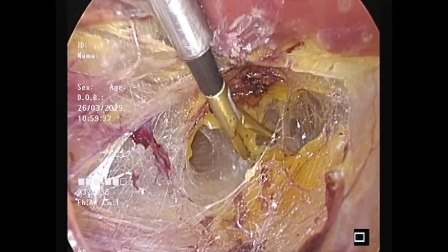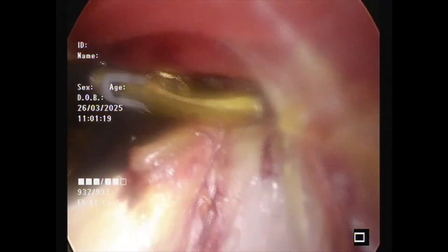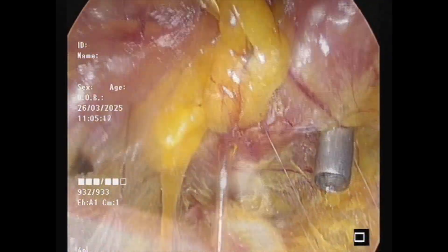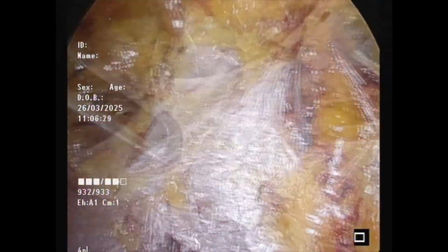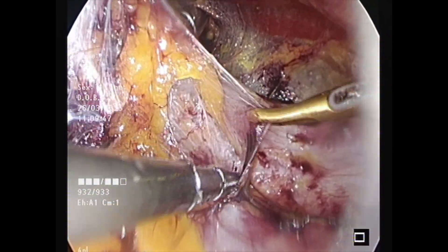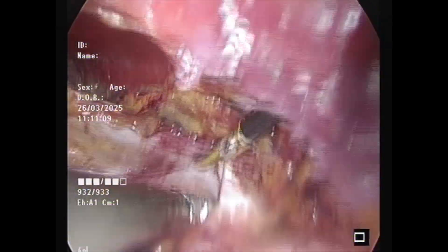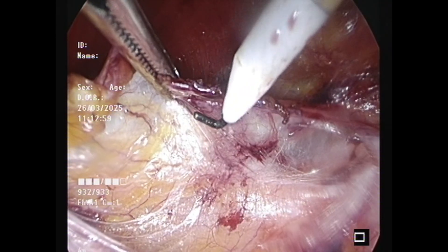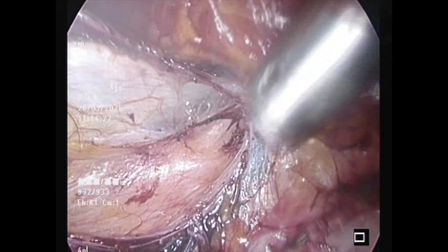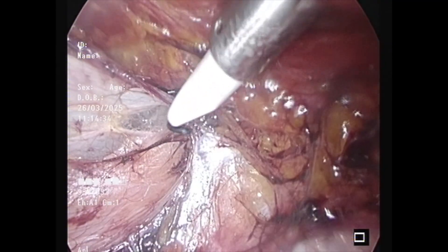Here I have dissected the Stoppa plane and put in the left hand port. When looking cranially this is the optical port. Once the camera is turned inferiorly, you can see this particular patient had a type 3 arcuate line. So I have created a neo arcuate here. You can see I have picked up the transversalis fascia using the hook, and now you can see the shiny PRS superiorly and the peritoneum and transversalis fascia complex going down.